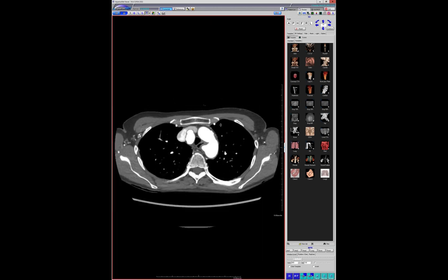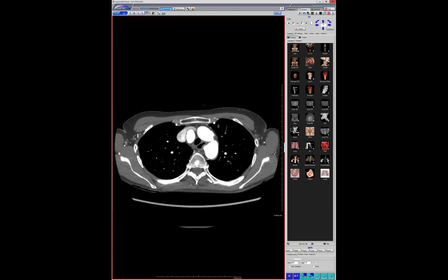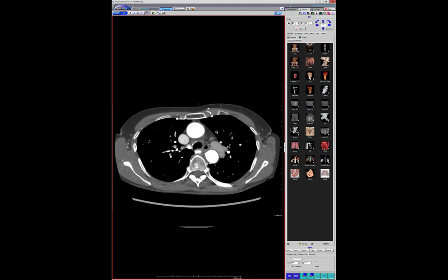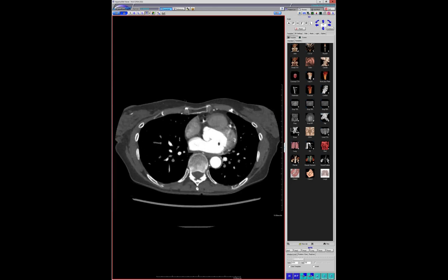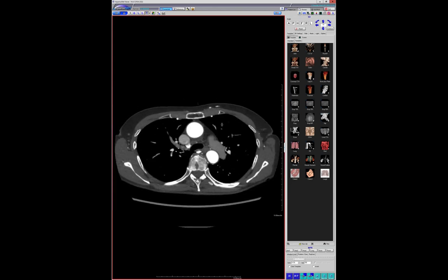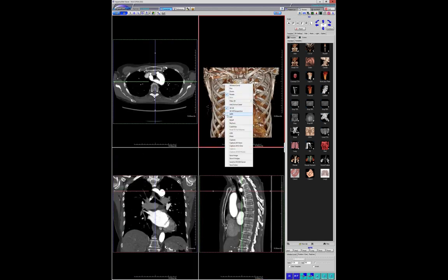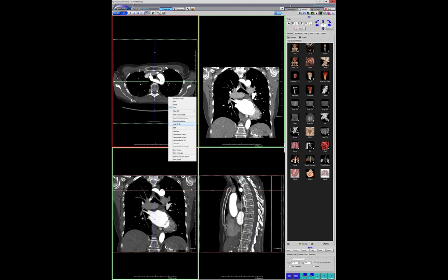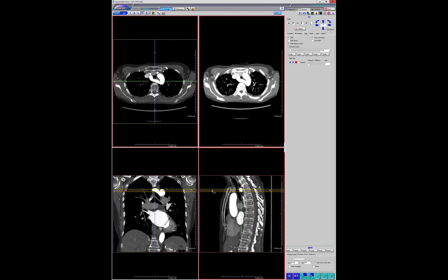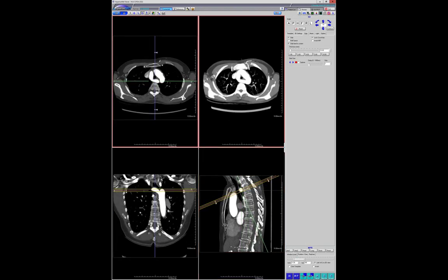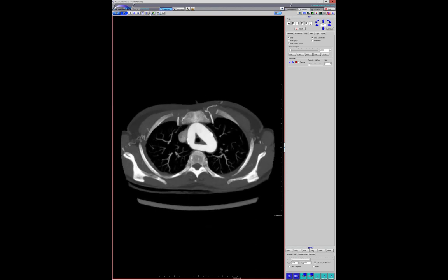This is a double arch where the left arch is the large dominant arch, and there's a very small right arch. I went back through — I maybe have about 10 double arch cases — but this is the first one I could remember with this actual morphology. Have you guys seen a lot of double arches with this? Everyone I've seen has been the right-dominant one, as the literature supports. But yours is a left-dominant one. That's so cool.